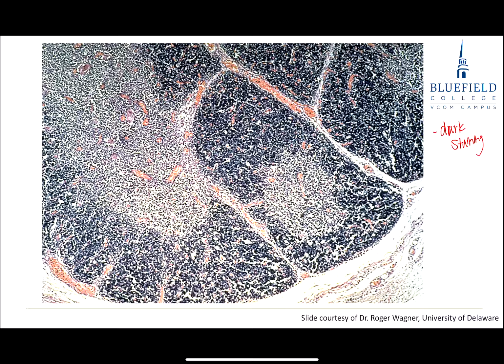Now, if you look at it though, that's trabeculae coming in off the capsule right here. This is a lobe. In this case, the lobe actually has a cortex and a medulla. That's not that common. You look over here, I've got something that doesn't fit that anymore. The fact that I'm dividing it into lobes or partially dividing into lobes here is not something you're ever gonna see within a lymph node, okay? The fact that it's got lobulations to it, don't get caught up in that, realize that this is a lobe because it's separated out. It's not a lymphatic nodule.